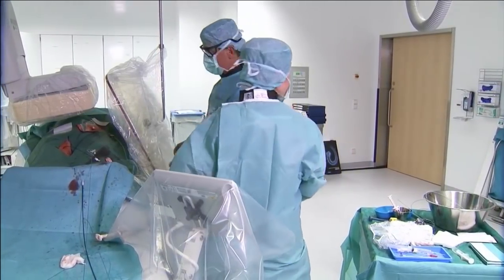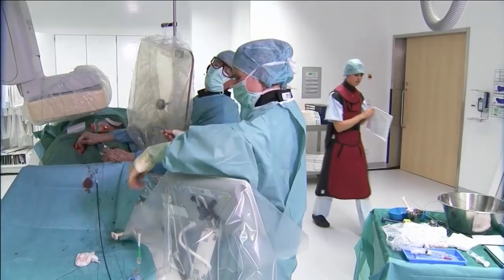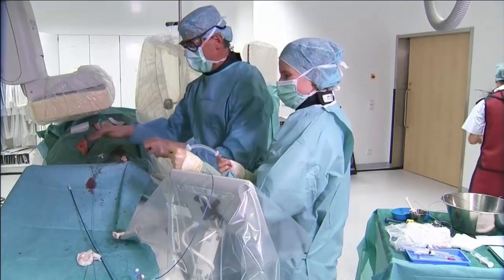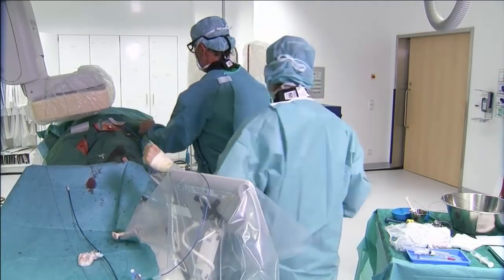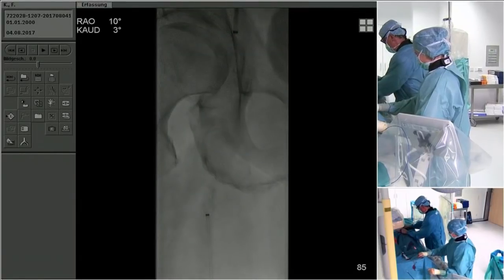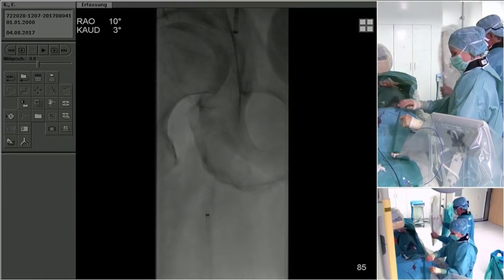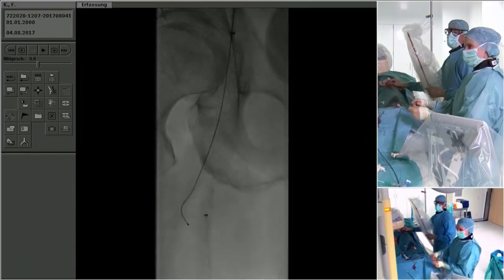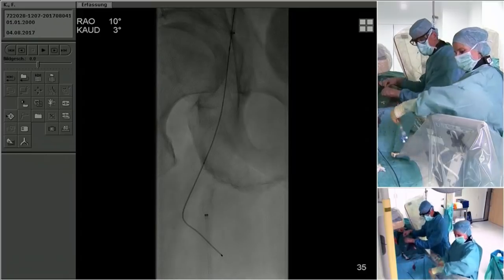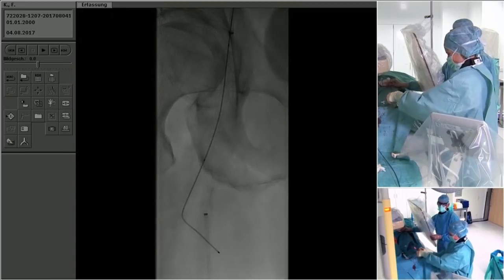Noch einen kurzen Supercore. Yeah, I position that sheath from retrograde as far as I can. Halten. Well, for this, indeed, you need quite some patience. And we will let you focus entirely on the procedure and not distract you, so we are watching very intently.